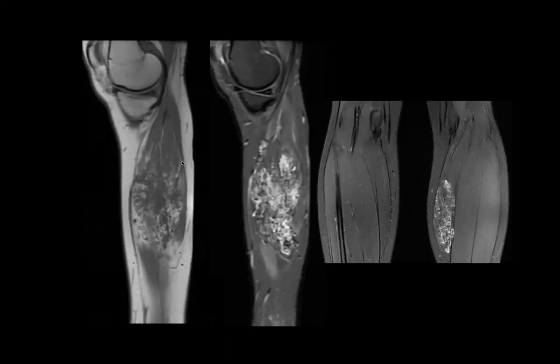So just a nice example. Here you see the femur bone. This is heading down towards the toes, right? This is up towards the head. This is the front of the body, the back of the body. So here we have spin echo T1, right? And then this is fat suppressed post-contrast imaging.